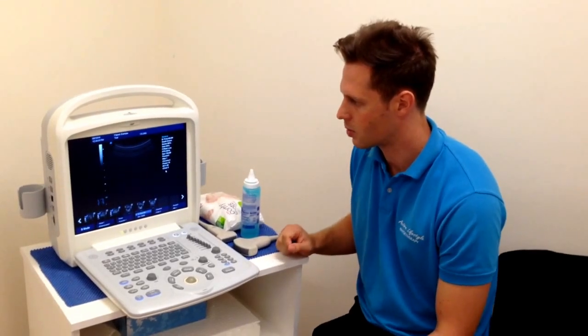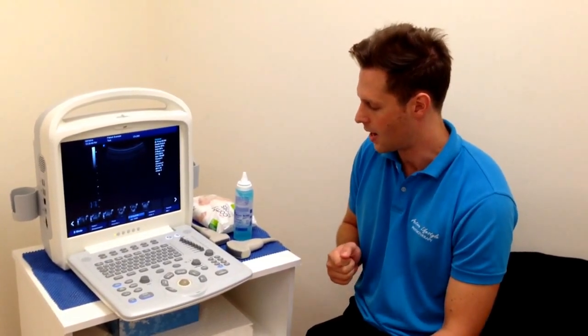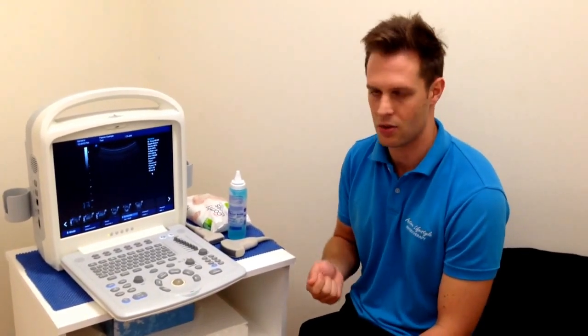From our point of view in practice, we tend to use it for visualisation and retraining of the core muscles — so the transverse abdominus, the multifidus, and the pelvic floor. We also like to show patients pathology at certain times, whether it be in a tendon, a tear, or some collection of fluid such as bursitis.